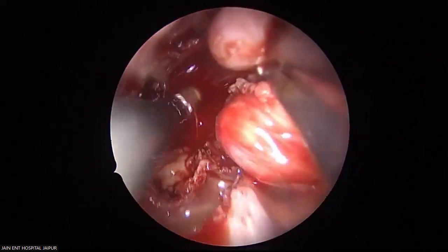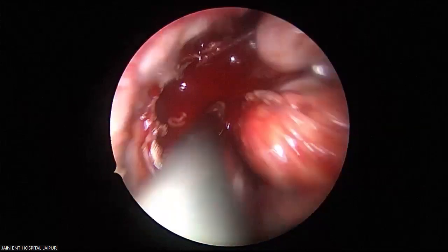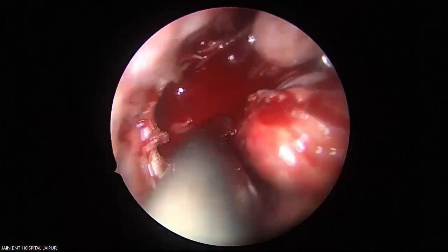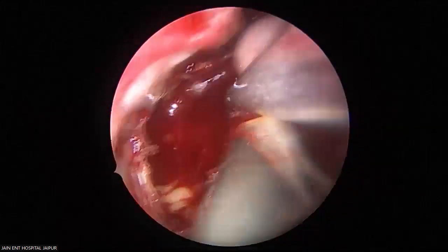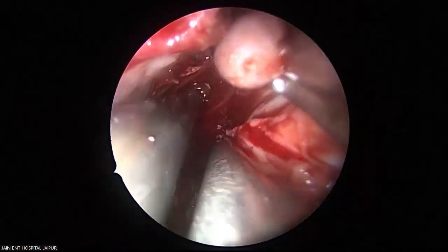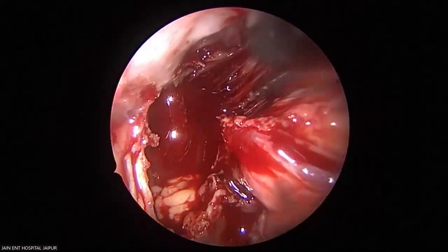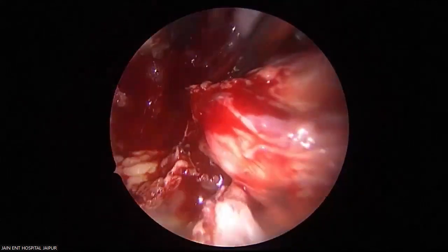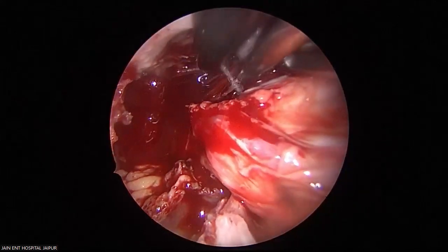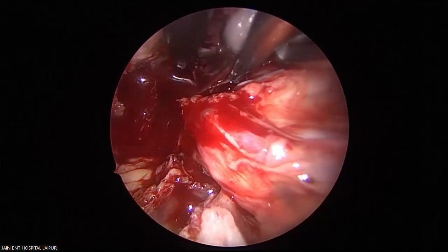So nicely come out. Yes, yes. Small vessels we tackle with coblation. The more these adhesions are released, the tumor will be released.